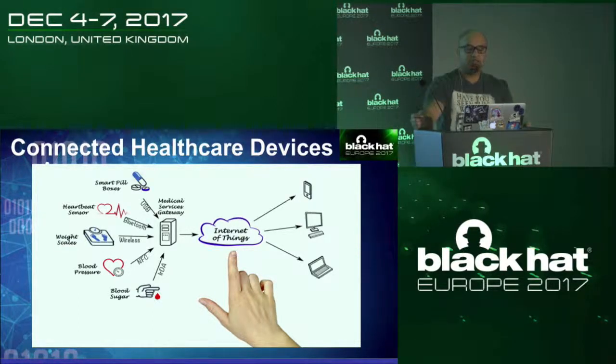And these devices can talk on a lot of protocols. So they can talk over Wi-Fi, cellular data, so 3G, 4G, LTE. They can talk different protocols like Zigbee, Z-Wave, etc. So, for example, your Apple Watch talks to your iPhone over Bluetooth, or say, for example, if you have a Fitbit weighing scale that can connect to the cloud infrastructure and share data with it over Wi-Fi, an insulin pump or an infusion pump in a private hospital connects over Wi-Fi or wired connection, so on and so forth.